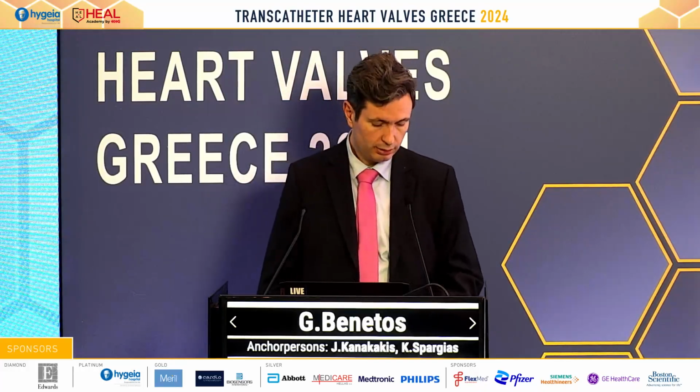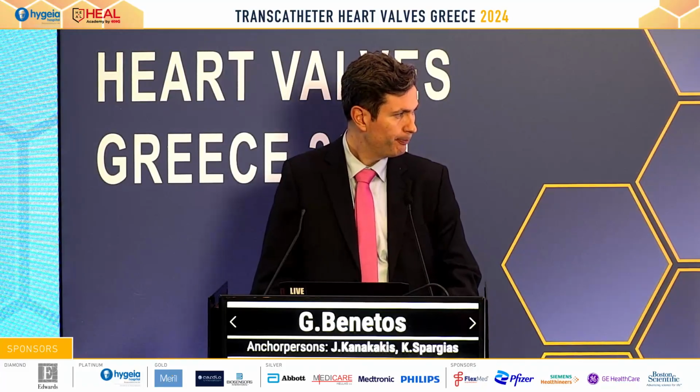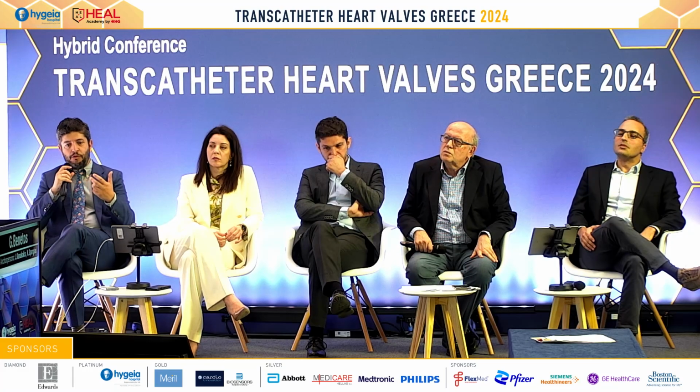Sorry, but I mean also the opposite. If the echocardiography is not sure if the aortic stenosis is severe, say in patients with, let's say, paradoxically low flow, low gradient AS or other compelling echocardiographic studies, then can we base our decision on the CT scan? If the calcium score is very high... In extreme cases, for example, a calcium score more than 3,000, then I'm sure that's severe stenosis. In other cases, I have a calcium score of 100, so I'm sure that it's not a severe stenosis.